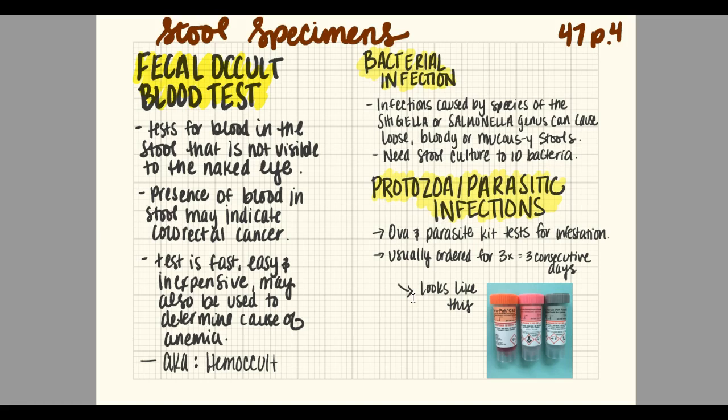They are easy to do for us in the lab. It's just a couple of drops of the controls over the back of the filter paper on the sample slide. You can watch the video that I put up on YouTube for that. Like I said, you're going to do these in class. For the patient, it's a little bit more difficult to collect them.